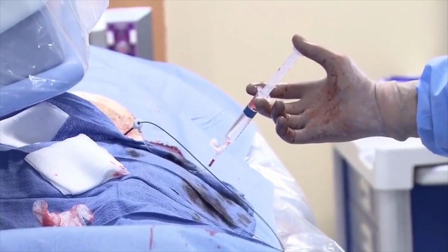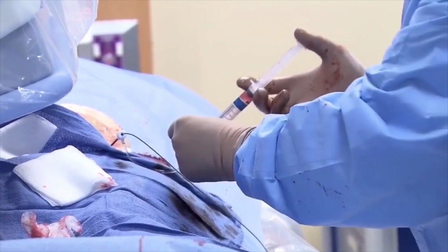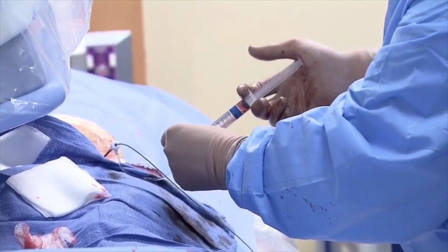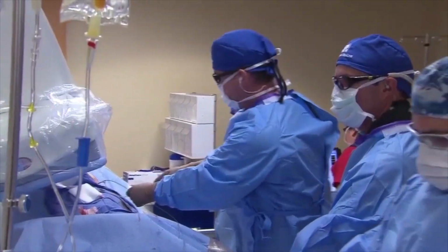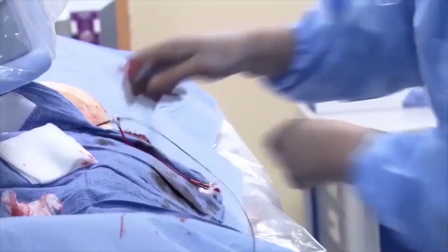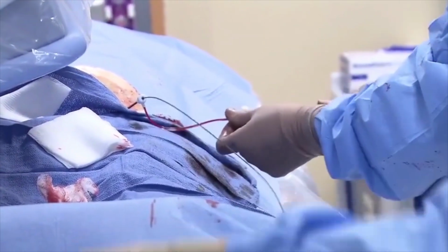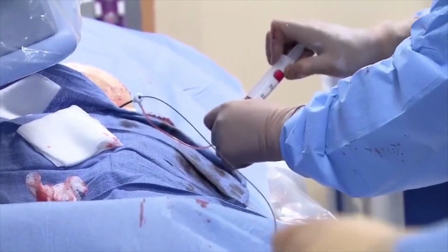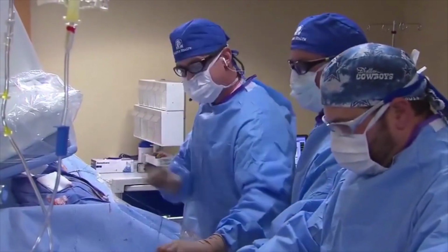So again, I'm going to get us a subtraction image here, a roadmap image rather, so we can sort of get the lay of the land. There we go. We'll take a 5mm Spider X filter, please. Dan, let me run this wire down just a tiny bit further there.